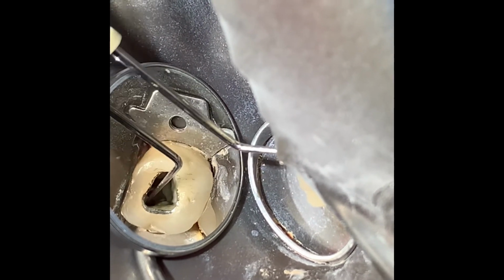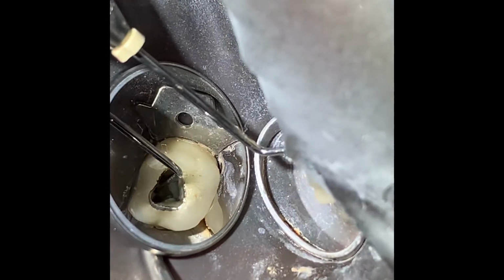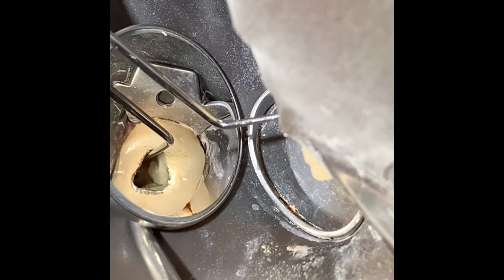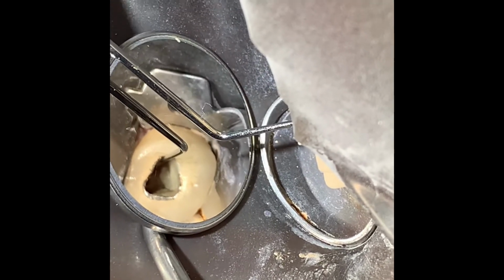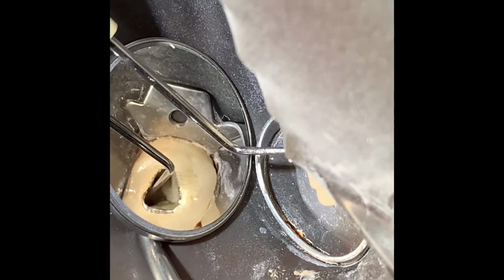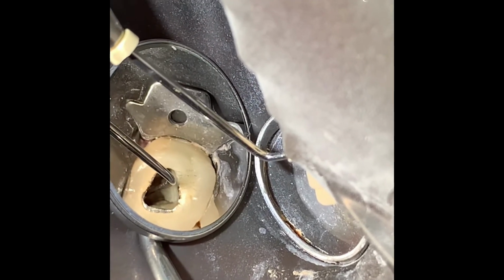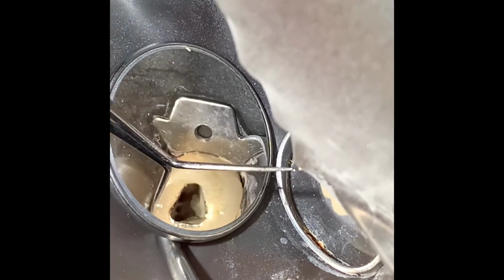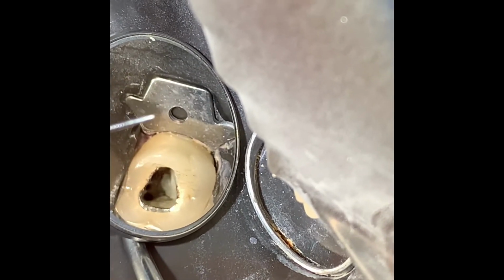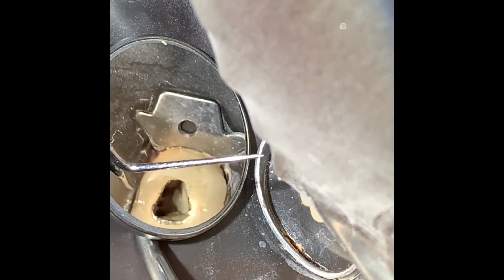My Explorer is in it. So MB1, MB2, and MB3 now. So she had missed the MB2 and found the MB3, thinking that the MB3 was MB2, but of course it wasn't. So we located the missed canal right there, and I'm optimistic now about this tooth. But it goes to show you guys that even an endodontist can miss canals, but not this endodontist.